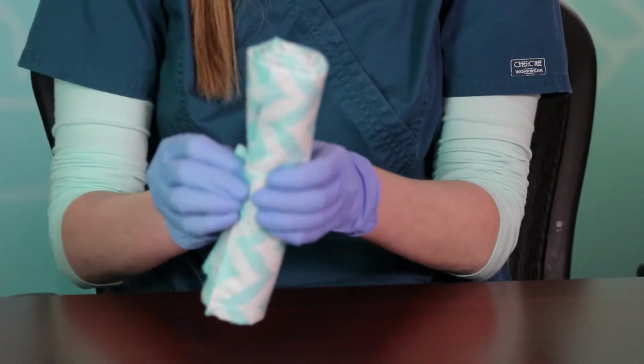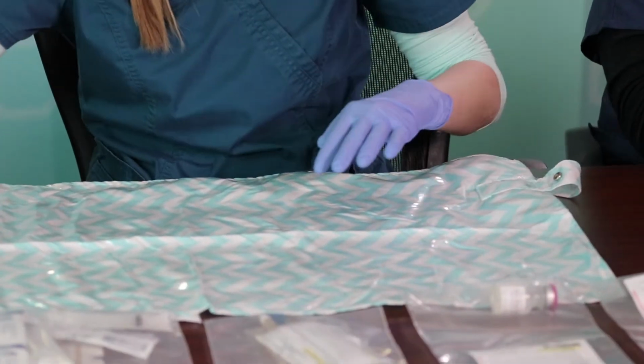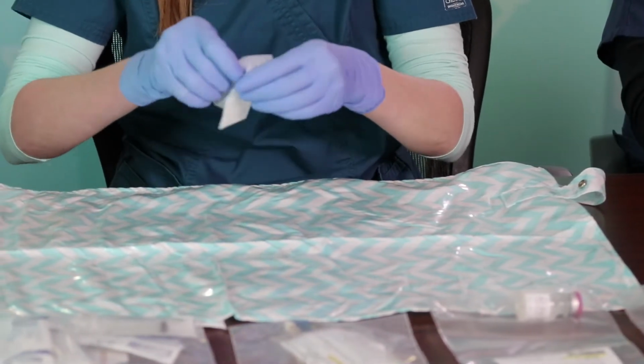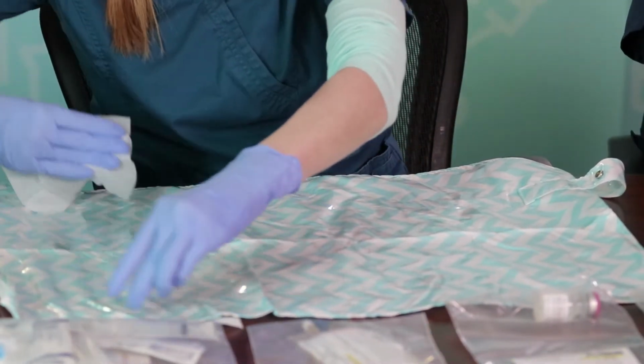Now you're ready to assess the patient and obtain access per policy. Once you have done so, wash your hands and don non-sterile gloves. Now we will prepare our field for mixing. Wipe your hard surface or barrier with a Sani wipe and allow to dry per manufacturer instructions. Once the barrier has dried, remove products from the packaging and place on the field.